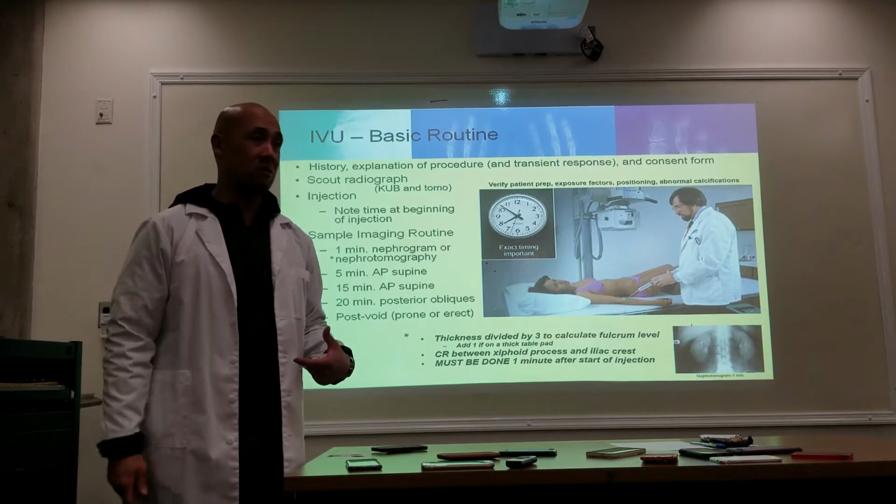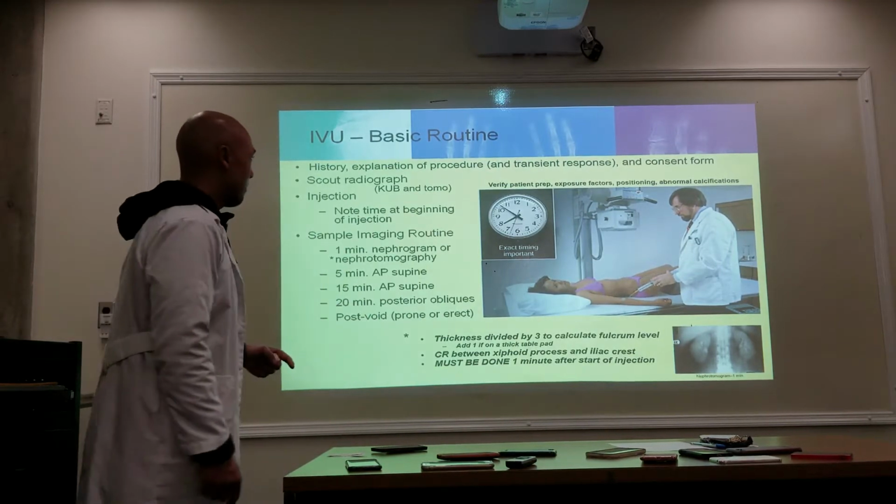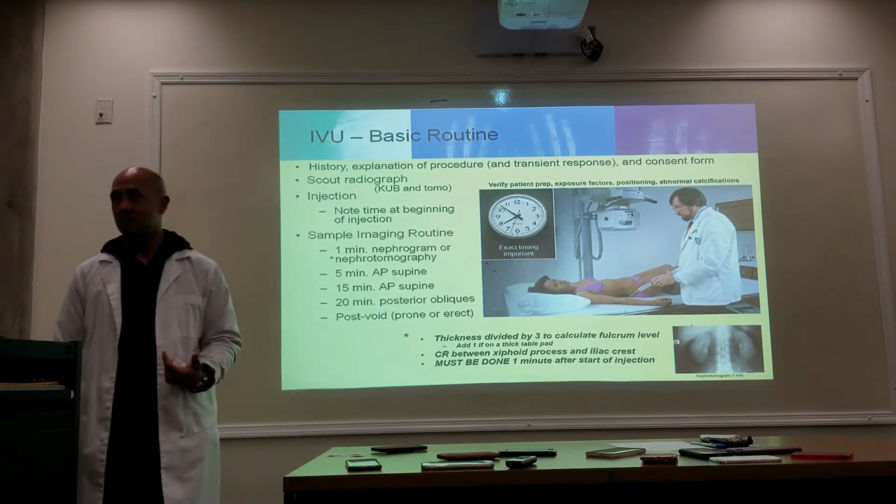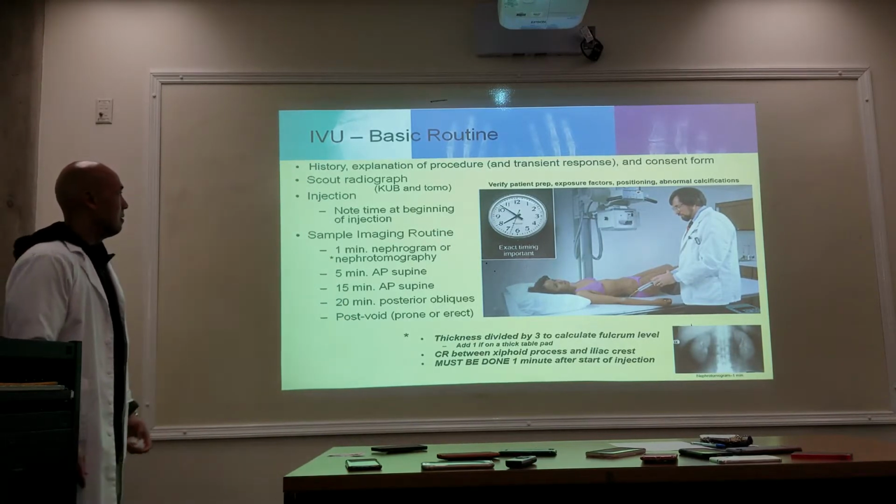Taking two scouts, a KUB and a scout for just the kidneys. Okay?